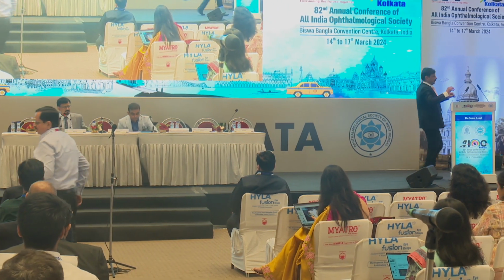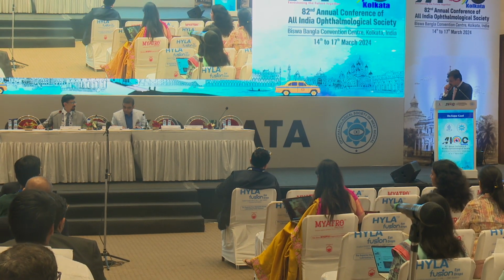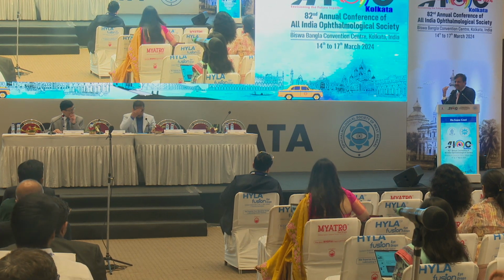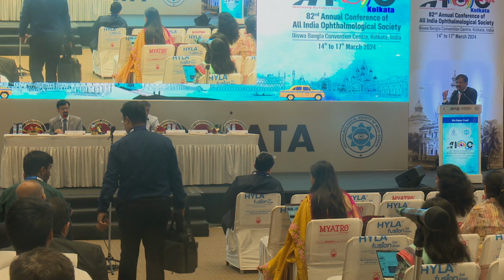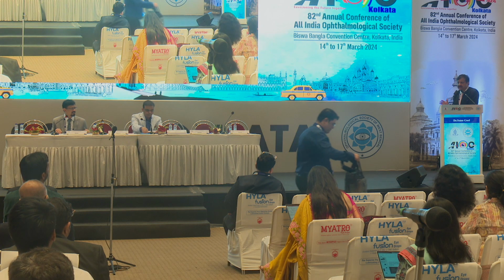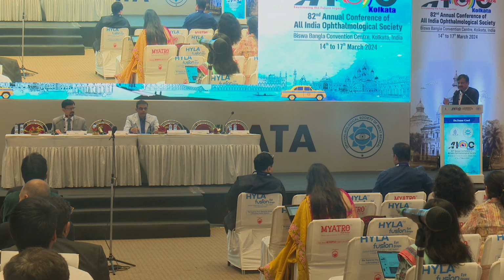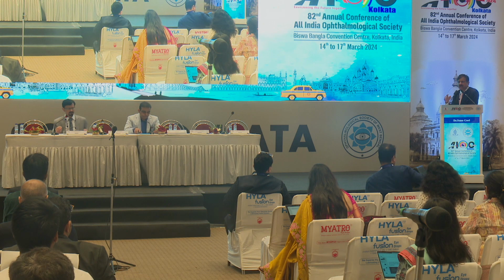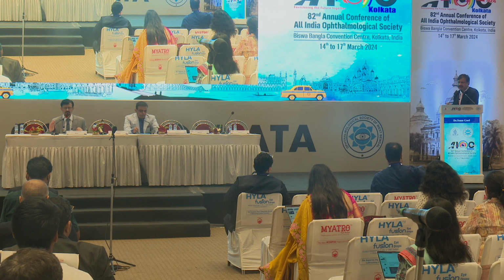Very true. But sir, I'd just like to interrupt in this. Actually, in your practice, you would have noted whenever you're treating patients who have a very flat cornea or a very steep cornea, when you take these patients on a femto platform, you're hardly concerned about the K readings. But when you take these patients on a microkeratome-based system, you're very conscious that you might end up with either a free flap or a buttonhole. So whatever the improvement might be, some kind of dilemma in the mind always remains, and you are a little extra cautious. So I think it is these extremes of patients which are very important when you're dealing with such a subset.